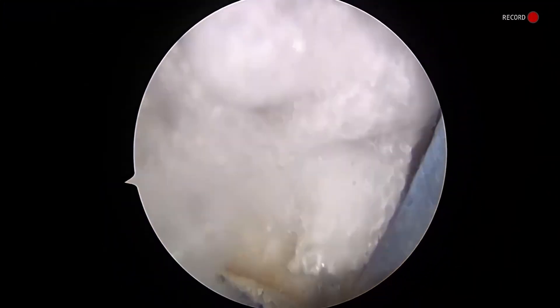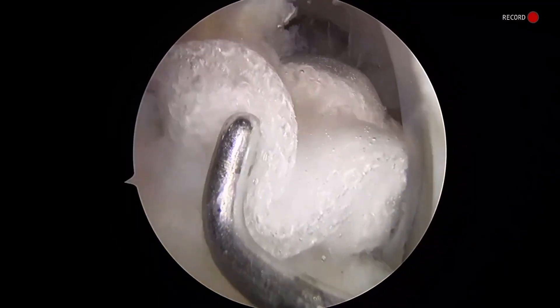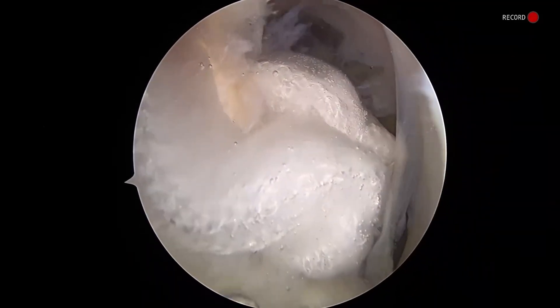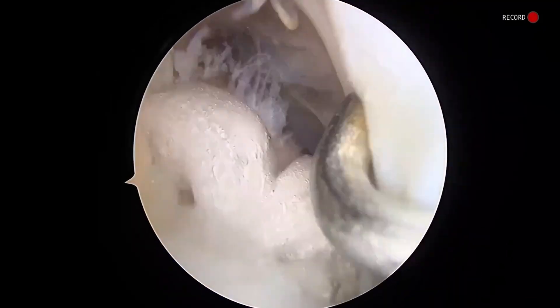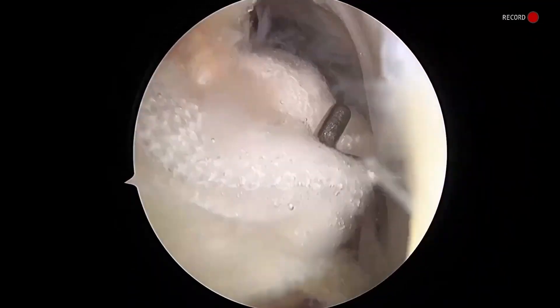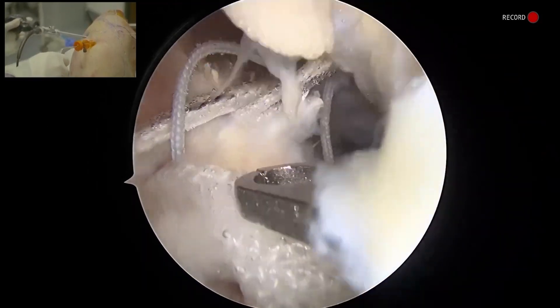Now we have our first lateral anchor in. You can see our BioBrace augmentation here — it's a little bit bunched up, but you can sort of flatten it out. I like the extra coverage here that it gives, covering the entire footprint of that rotator cuff, going across both the medial and lateral row anchors. Twenty-five millimeters gives me good, reliable coverage across most cuff sizes.